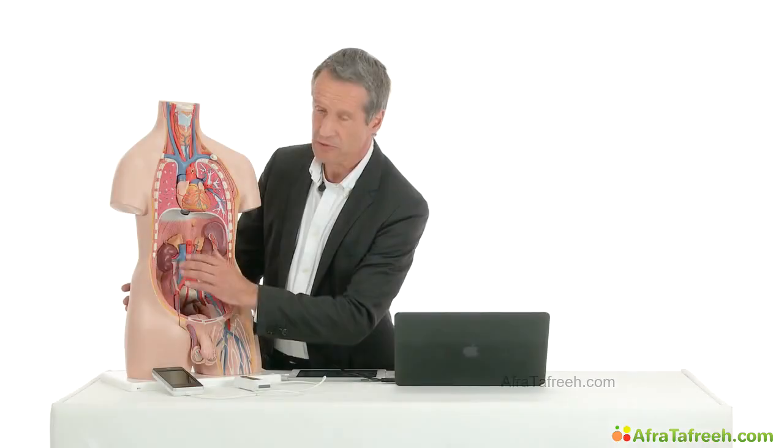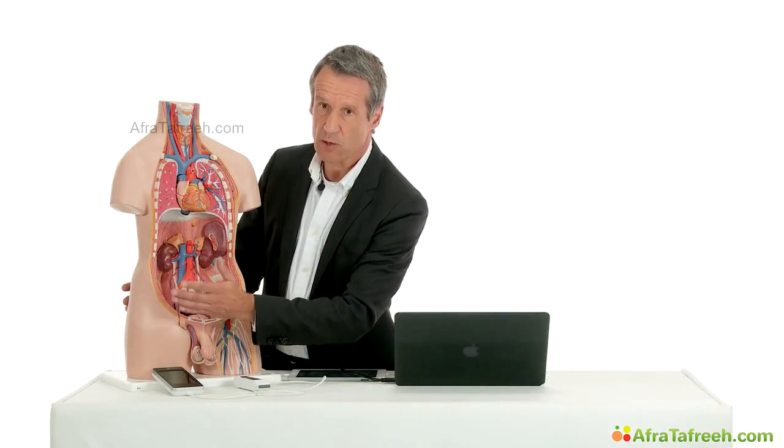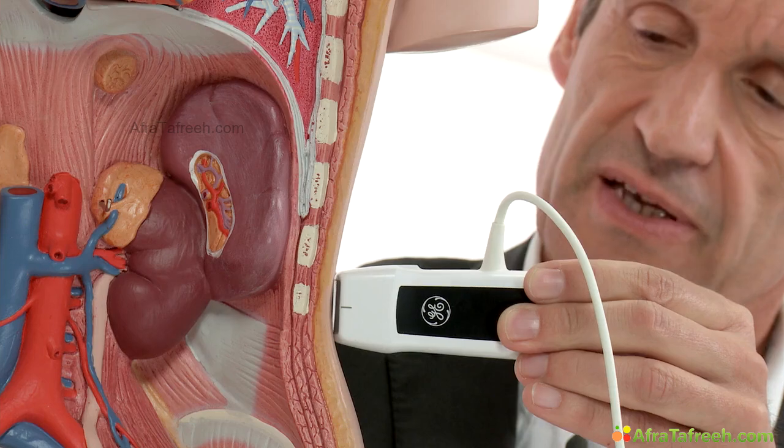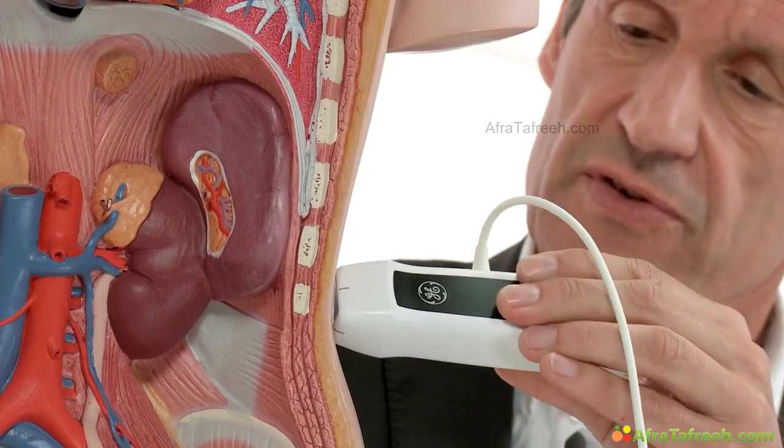In the following lecture, Professor Dirk Becker from the Agatha Reid Community Hospital, an academic teaching hospital of the Ludwig-Maximilians University of Munich, will explain how ultrasound can be applied in a primary care setting with a focus on imaging the kidney.